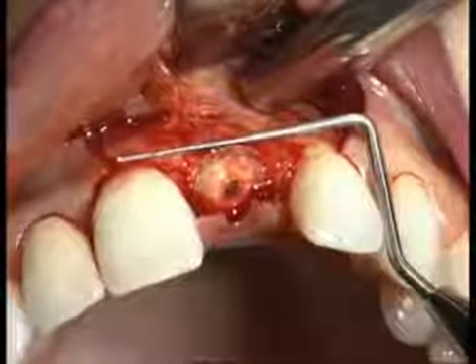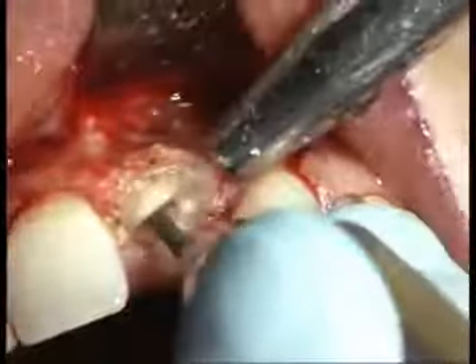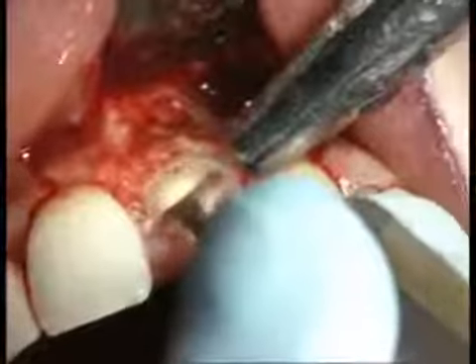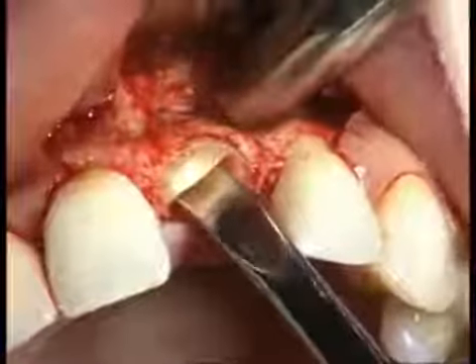It's important to remove the root carefully without fracturing the bone wall. To achieve this, the root is diagonally sectioned using a small Lindemann bone-cutting burr. Once this is done, the root can be fractioned longitudinally with a lever arm instrument.